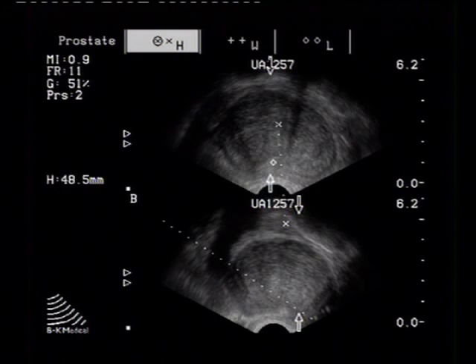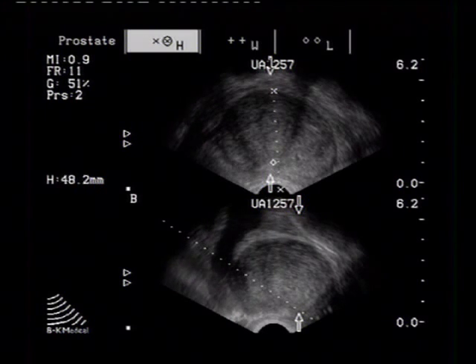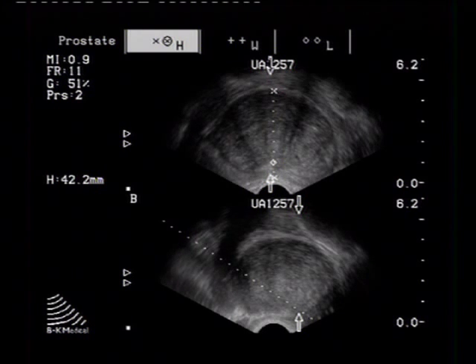The injected local anesthetic takes a few minutes to produce its full effect. During this time we measure the prostate volume.